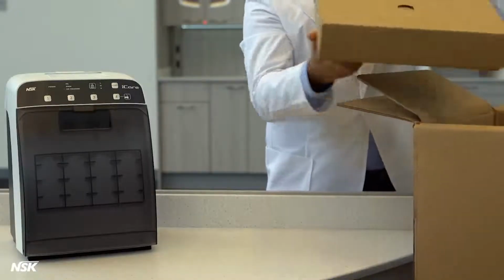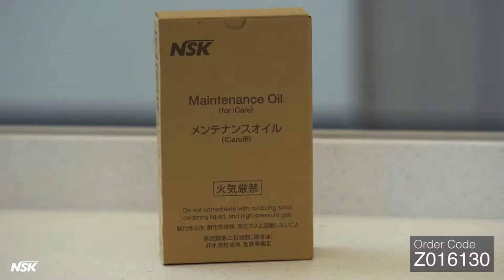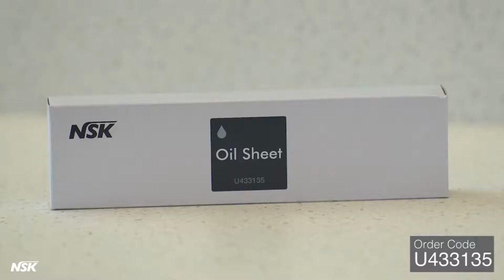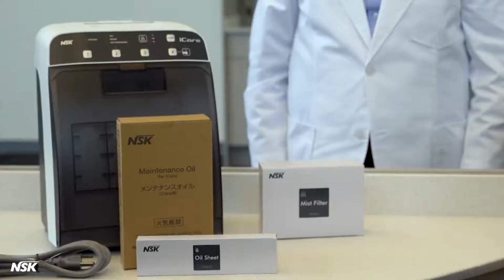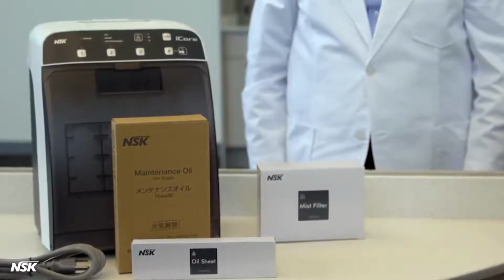Tucked away in the larger box is a smaller box with the remaining components. Maintenance oil for iCare with nozzle. Reorder using this part number. AC power cord. Oil absorbent sheet. Reorder using this part number. Mist filter set or sponges. Reorder using this part number. That covers everything inside the box. Now, let's move on to installing your iCare.